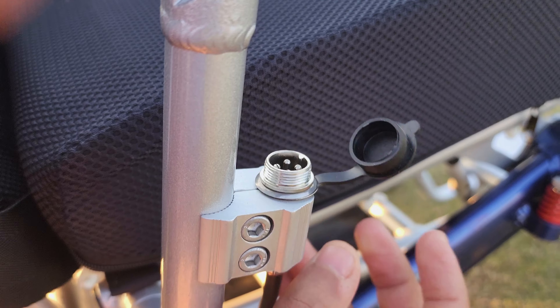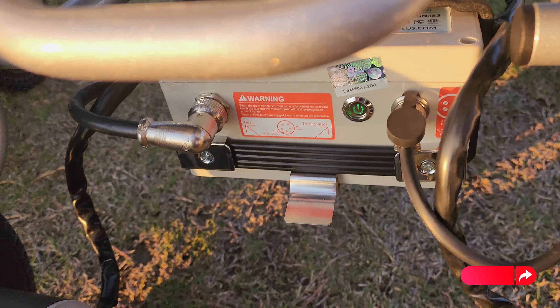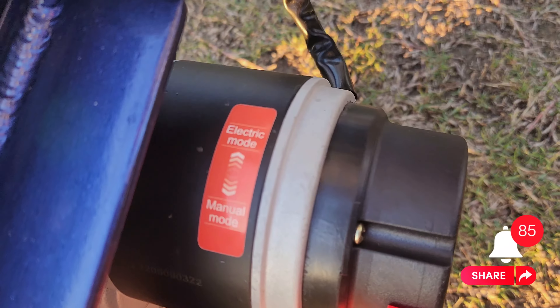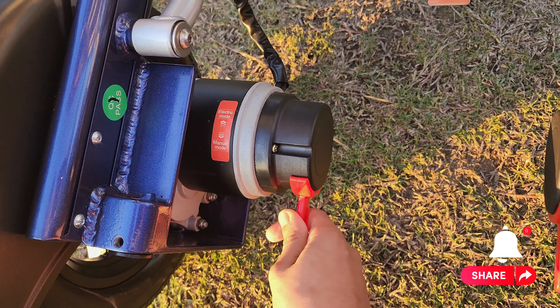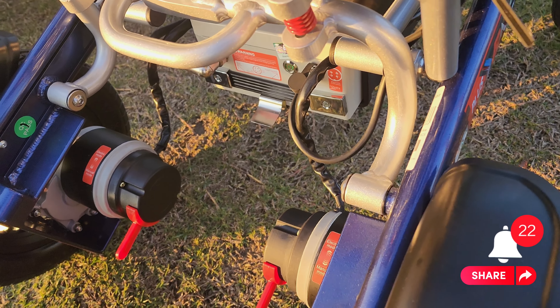You can also charge your battery from here — as you can see, this is hooked up from here to there. It's another way we make it simpler so you don't have to go all the way under the wheelchair to charge it. We also have electric and manual mode. It's very easy to switch.